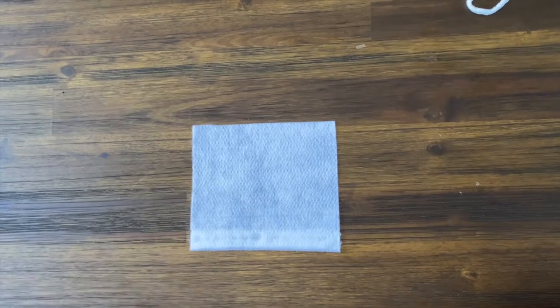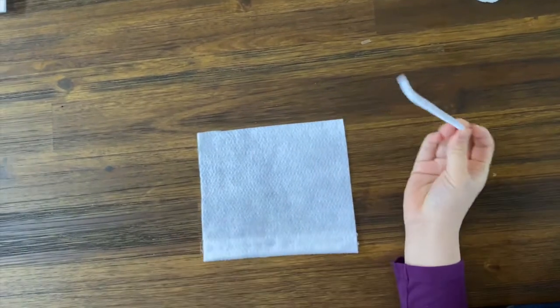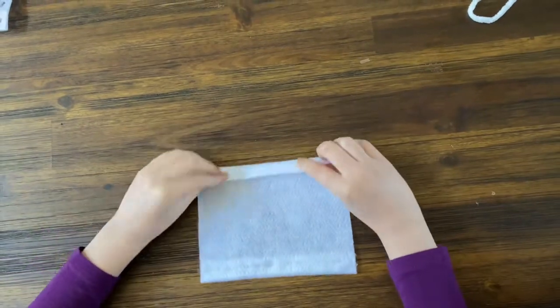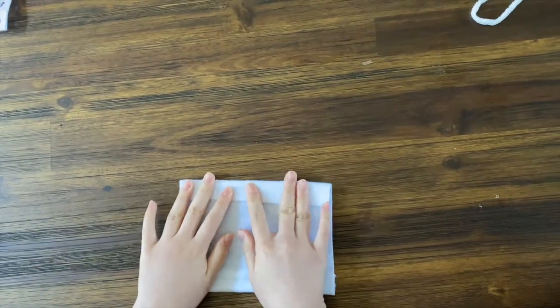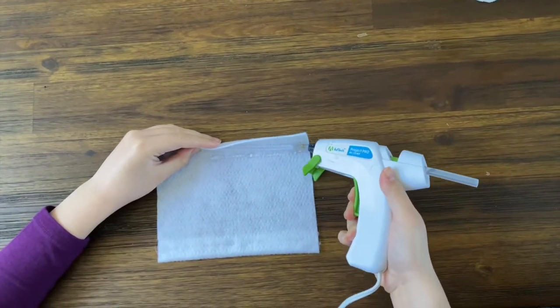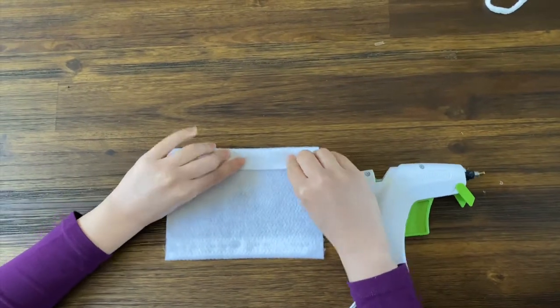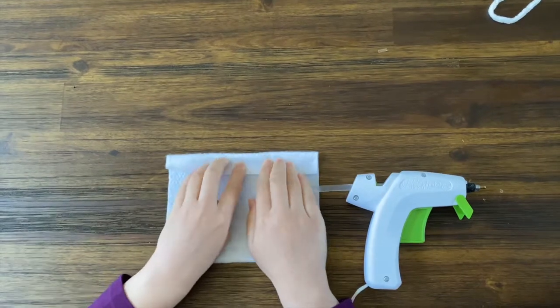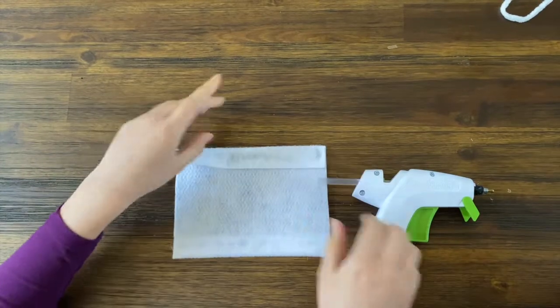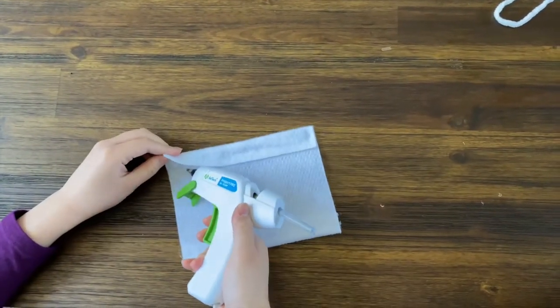So the first thing you're going to do is take a little cut in half pipe cleaner and your 6x7 piece of fabric, and fold over one of the sides like this. And then you're going to take your glue gun and go right underneath where the pipe cleaner is, and then a little up the side of half of it. And then I fold it over, press it down to make sure that the fabric and the glue are sealed together. Then I do the other side as well, same as I did the other one.